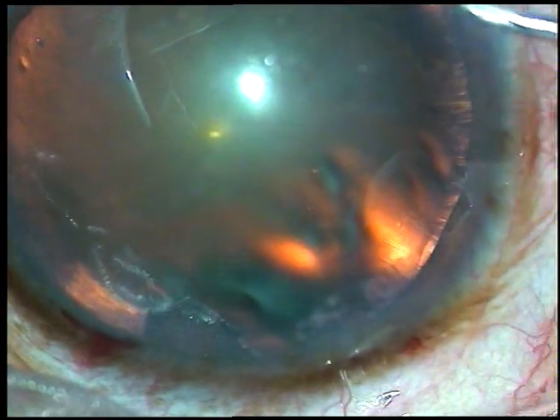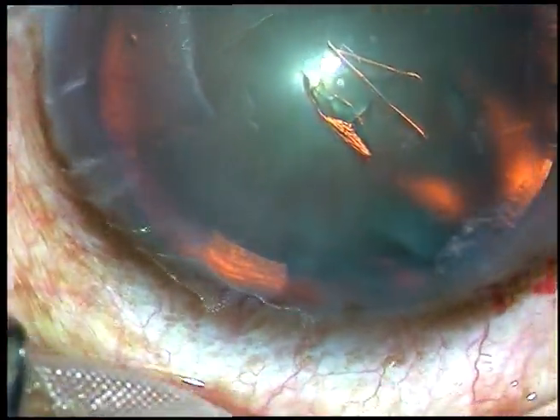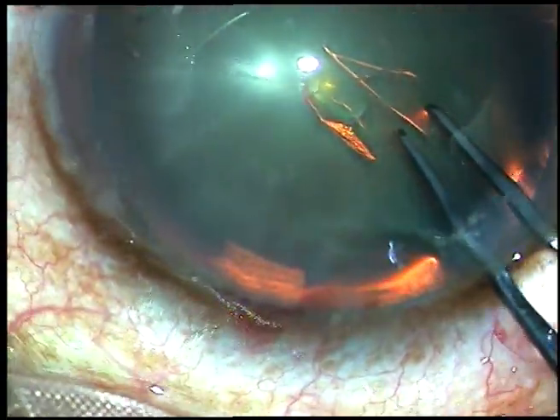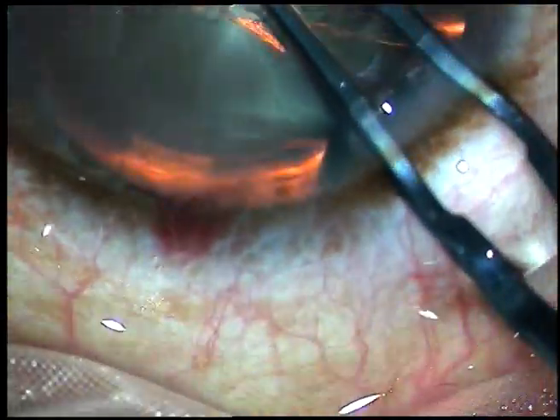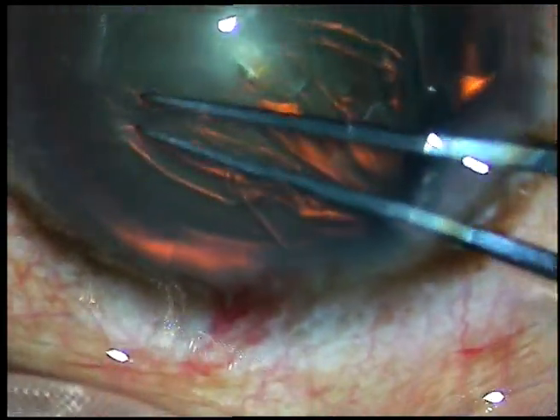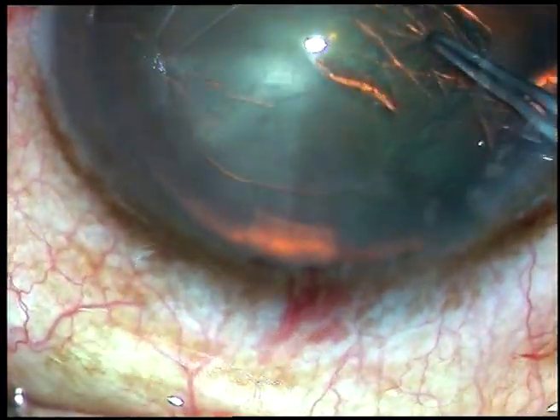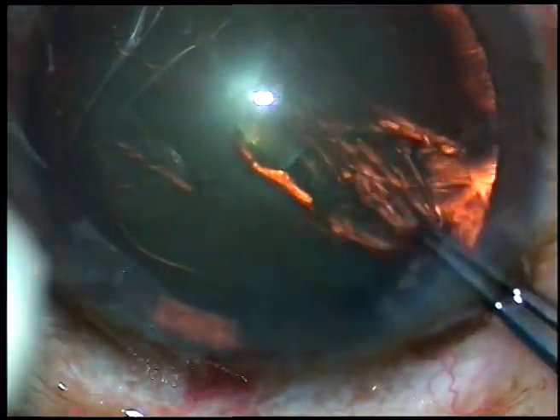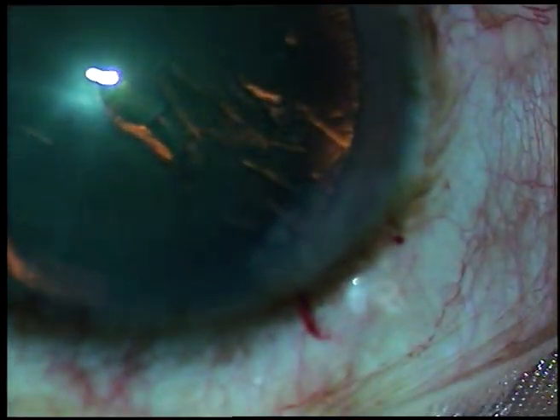Now capsulorrhexis is to be done. The anterior capsule is incised and a capsular tag is raised. I hold this capsular tag with utrata forceps, go anticlockwise and with three grasps, I complete the capsulorrhexis. I keep an upward thrust so that leakage of the viscoelastic substance is minimized.